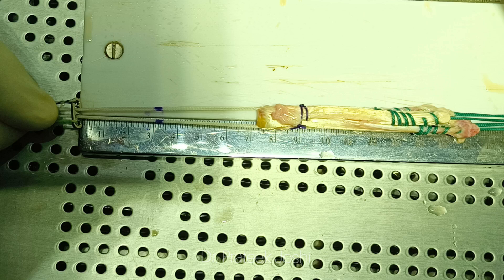In this video I am going to show you how adjustable loop endo button is used for ACL reconstruction surgery. In this picture you can see that we have prepared our graft by quadrupling the semitendinosus tendon and doubling the gracilis tendon. The length of our graft is 8 centimeters.